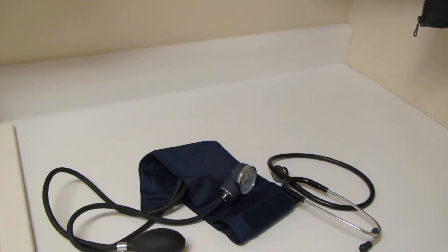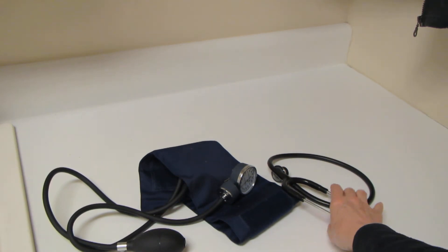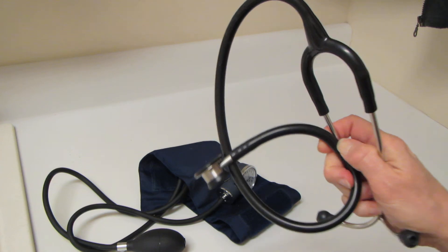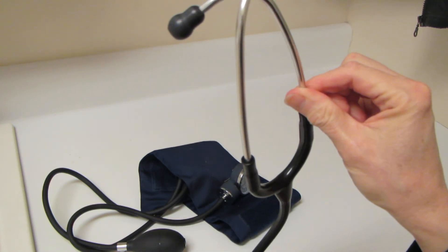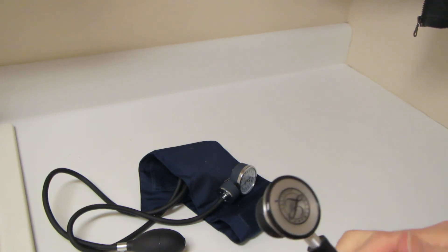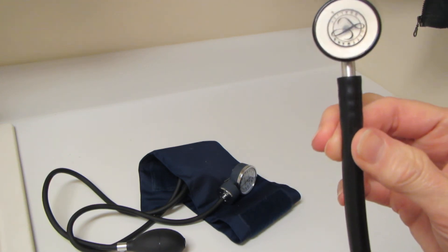Okay, the other thing we need to be successful measuring blood pressure is a stethoscope. I showed you this in lesson. We've got the ears that literally go in your ears, the tube, and then the bell at the end.